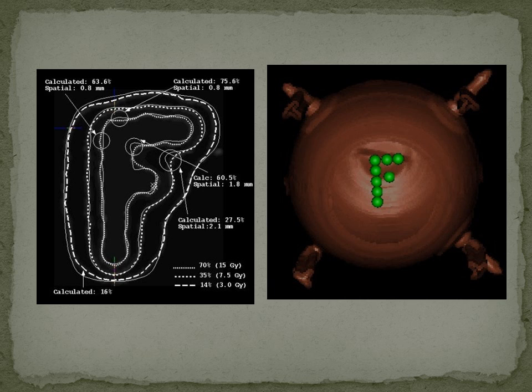You can create very, very complex distributions. And here we've just shown that we can write UF in the phantom. This shows two things. One is that we can create very, very high doses of radiation. This is 10 millimeters, so the distance between the dose and half dose is again about 3 millimeters, about our standard. And the other thing it shows is that this is the planned dose, and then we actually took a sphere of something called a radiochromic gel that allows us to expose it and then develop it and figure out where we actually deposit the dose.